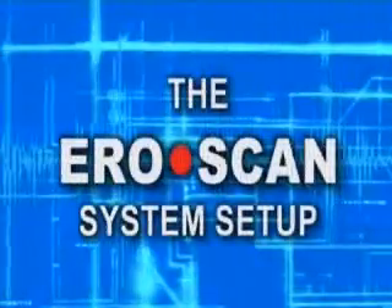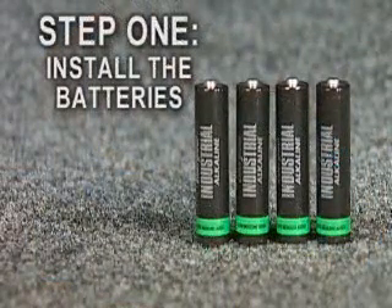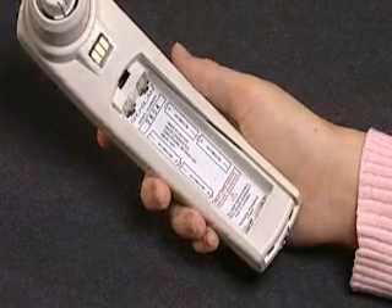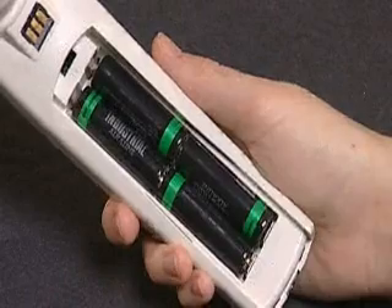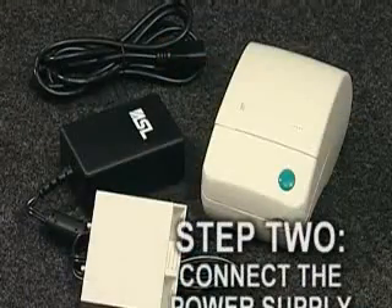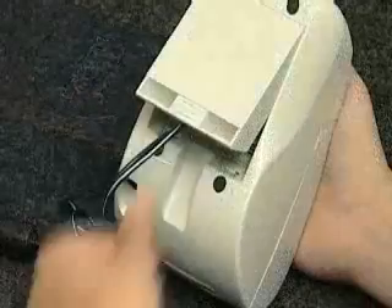Now we will cover the four easy steps of the Ero-Scan system setup in more detail. In step one, install the batteries by opening the battery compartment on the Ero-Scan by sliding the battery cover down. Install the four batteries as shown on the diagram in the battery compartment, then close the cover. In step two, connect the power supply to the printer by first connecting the power cord between the wall outlet and the supply, then connecting the supply to the printer.